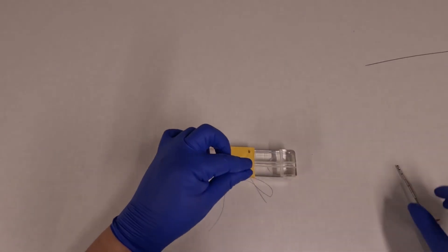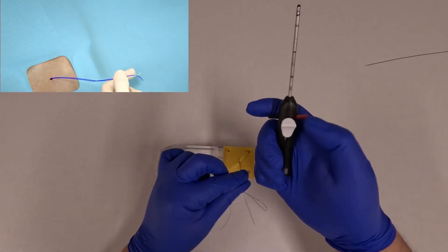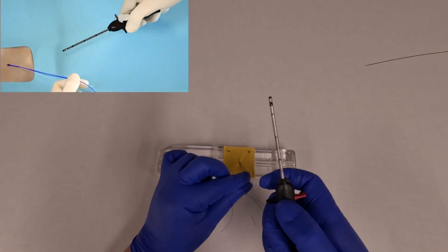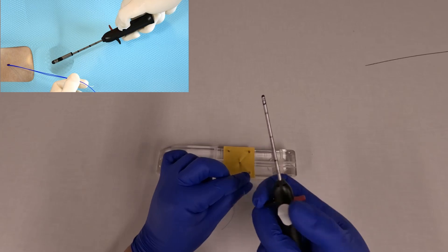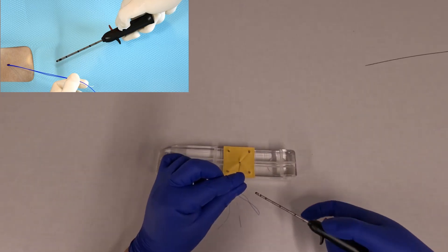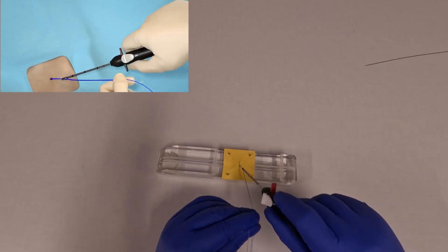Next take both the blue and white suture together and feed them onto the suture cutter. The suture cutter has two levers. The white lever opens and closes the trap door, and the red lever is what cuts the suture. So put both sutures in as you pull the white lever back.